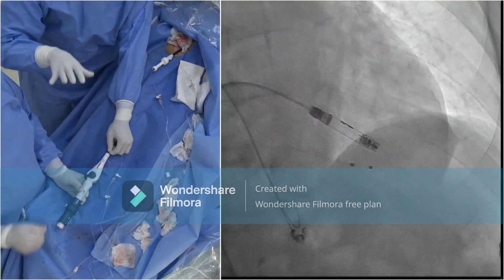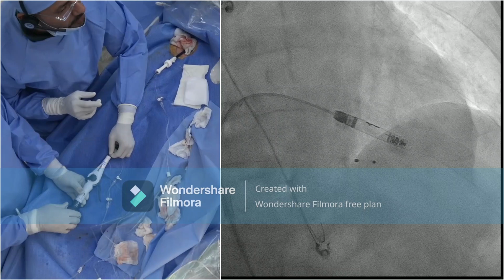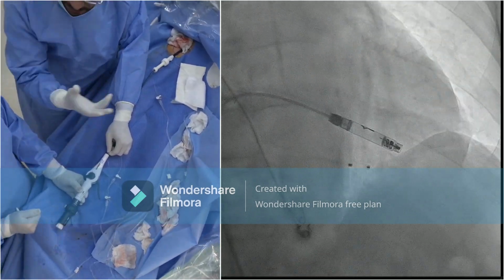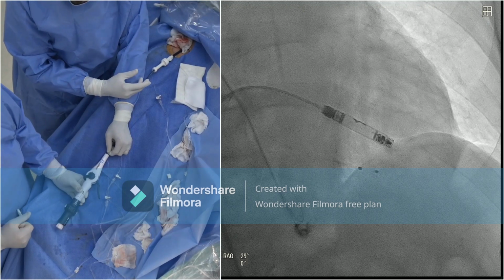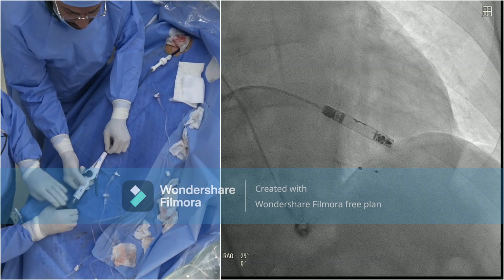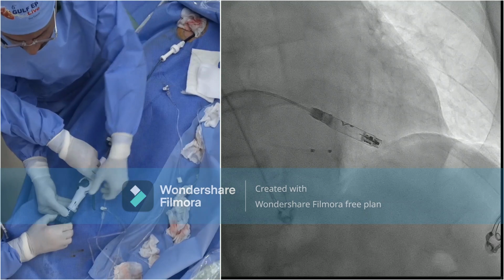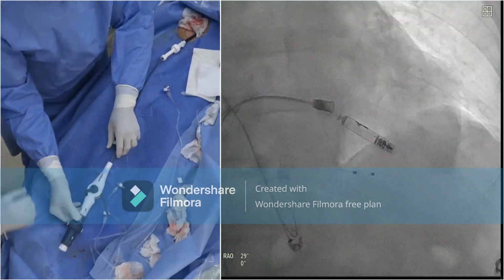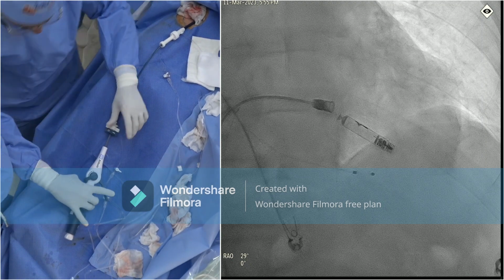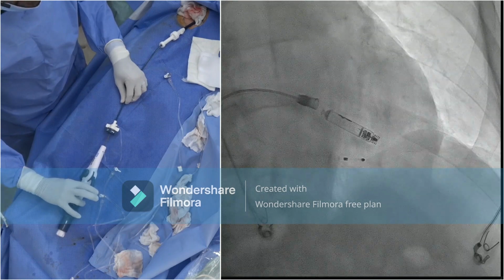It's very good when you have a big crowd and big team and consult them. Better than one eye. So this is very good. So at this stage, we are happy, and we can take our parameters to see how it's behaving now. Tether mode. We're going to go to tether mode. So show the hand, please. Right hand fixing the blue and then the white into the blue. Now, excellent. So now we can take some parameters and we can jiggle it a little bit to see if the device is well fixed.